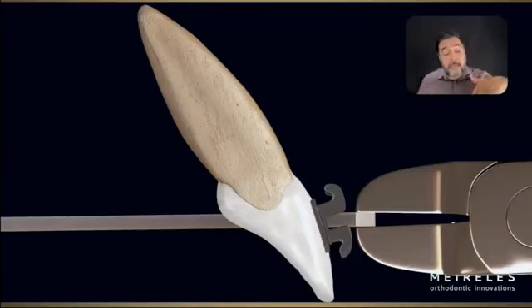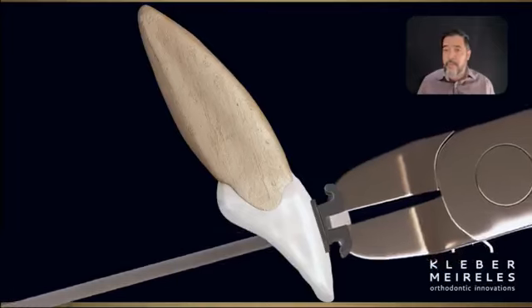Because the teeth have the right inclination of the crown and the root also, and the angulation and inclination in edgewise brackets are zero. So if we have a good inclination of the crown, let's say this central incisor, and I don't apply the torque, what I'm going to have is a torque, a relative torque.